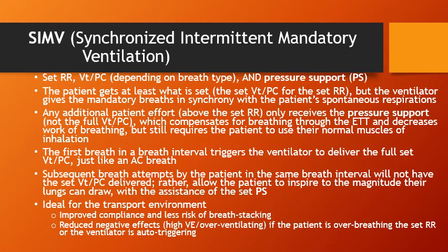But in SIMV, we're also going to set a pressure support, or PS abbreviated. So the way this mode works is that the patient is going to get at least what is set. They're going to get the set tidal volume or pressure control for the set respiratory rate.